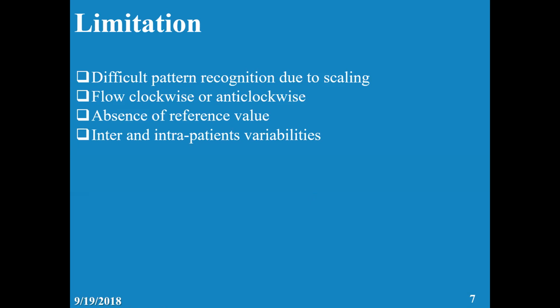Now the limitation of the graphs is the following: scaling. If you don't understand what scaling is, it is the size of the graph on the screen. Do you make it small or large? The larger you make it, the better you see, but you will see fewer numbers. So, scaling.